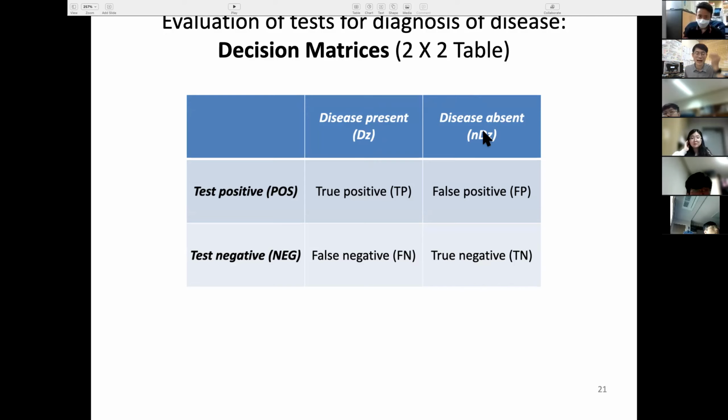But your detector, your instrument, only spits out numbers, for which you have to define a certain threshold. Higher than it, hey, you've got corona. That's what we call a positive test. And lower, below the threshold, a negative test.